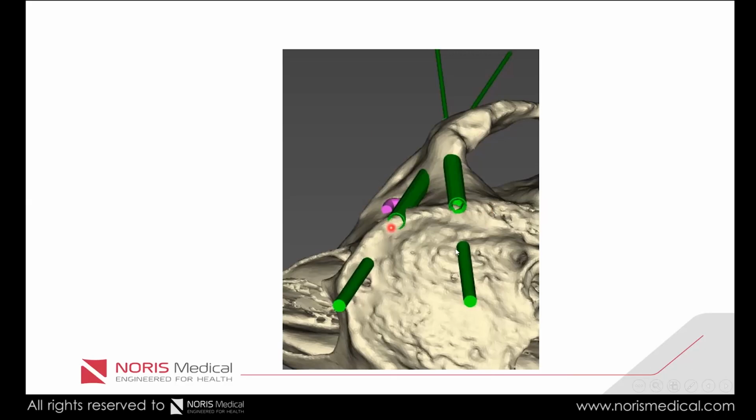But for my opinion, and it's only an engineering opinion, take it as that. My opinion says, first of all, we need to put the anterior implant, because we need to position the anterior implant as close as possible to the orbit, with nothing interfering in our decision where to put it. This is the most important thing.